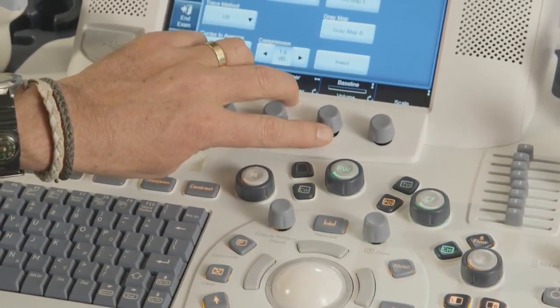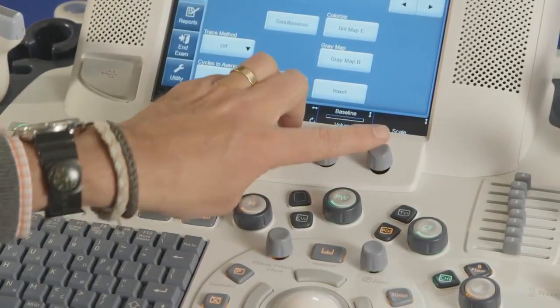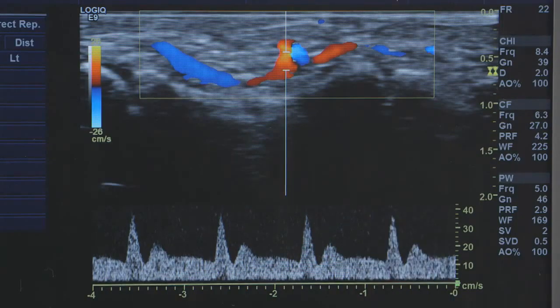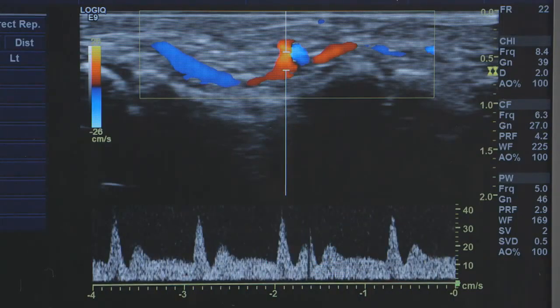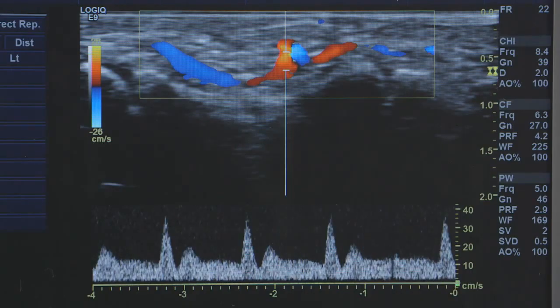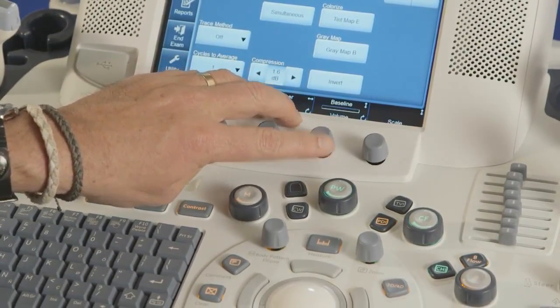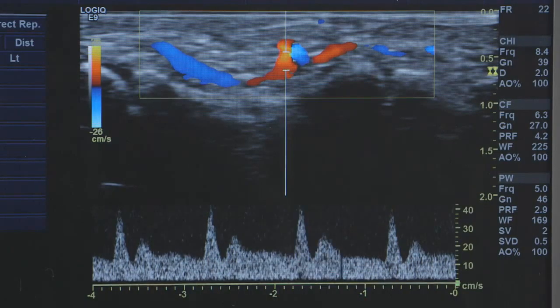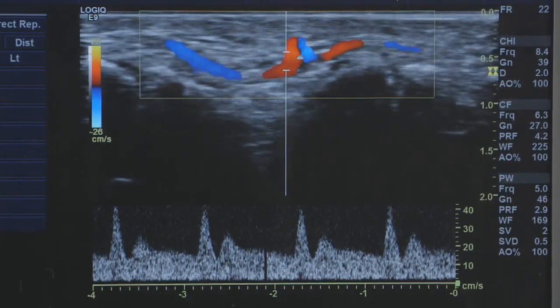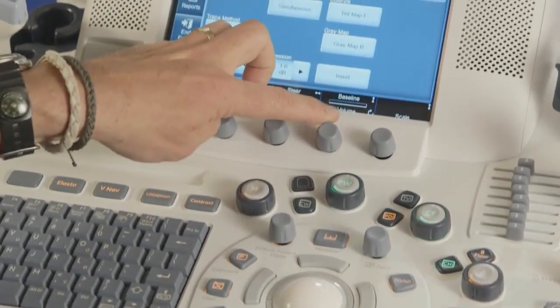Change the color flow or Doppler spectrum baseline to accommodate higher velocity blood flow. Minimize aliasing by displaying a greater range of forward flow with respect to reverse flow, or vice versa. Baseline adjusts the aliasing point. The default baseline is at the midpoint of the color display and at the midpoint of the color bar reference display. To adjust the baseline, move it up or down as necessary with the baseline toggle below the touchscreen.